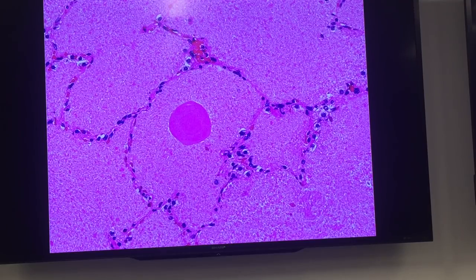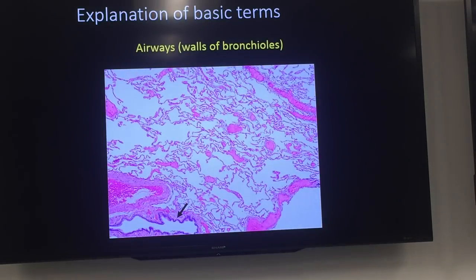So we did Ellie. Who's left for seniors? All right, go for it. Pneumocystis. Okay, that's an accept. Any other seniors with an alternative diagnosis? PAP. Okay, and both are reasonable thoughts, and we'll come to why it's one versus the other. And actually, part of the description that Ellie gave is relevant here. All right, so we will start with just basic stuff, but we'll come back to these pictures at the end of the talk, and we'll see if all of you can get everything right this time. All right, so the basic terms are this.